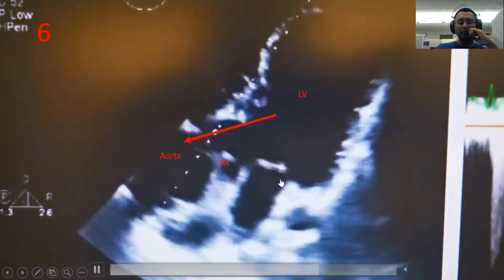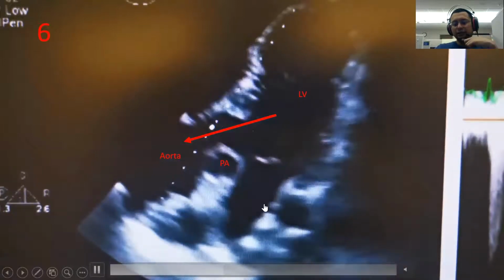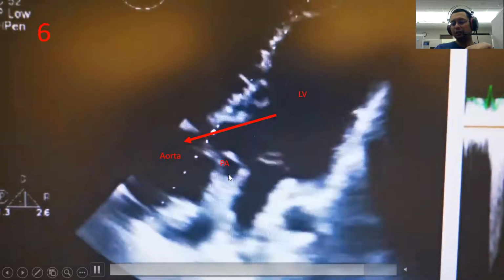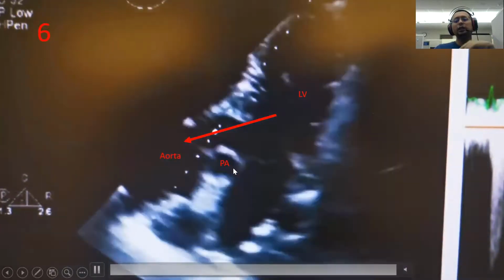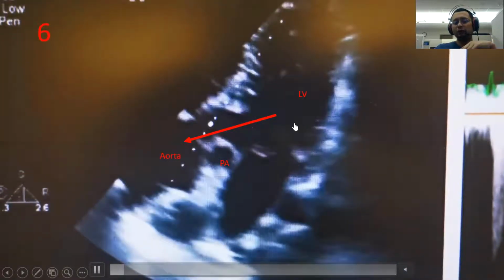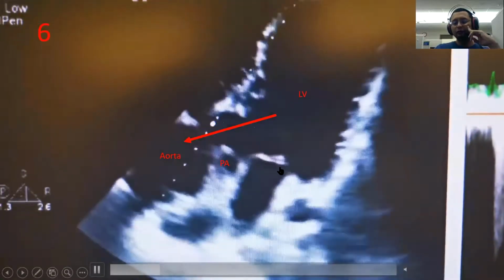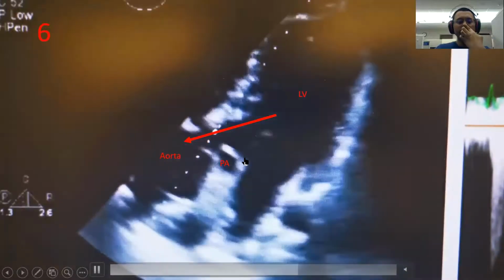What about the connection? You have the left atrium connected to the left ventricle, so there is atrioventricular concordance. But the left ventricle is actually connected to what here? The pulmonary artery. So the left ventricle is connected to the pulmonary artery, so you have VA discordant. You have AV concordant and VA discordant. Whenever you have AV concordant and VA discordant, what kind of TGA is this?